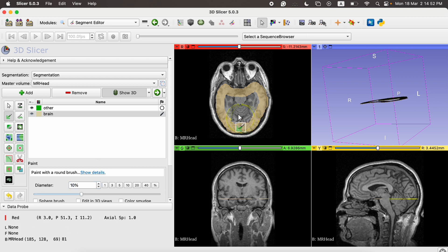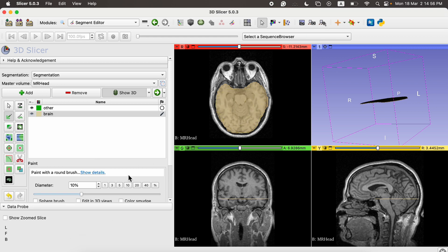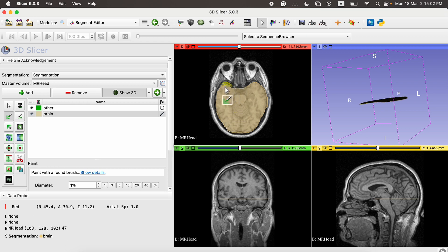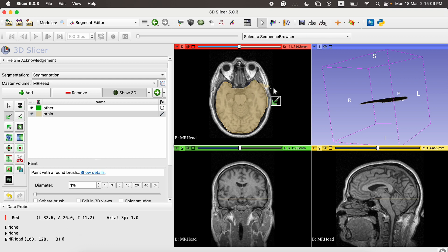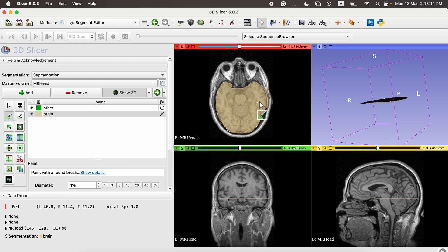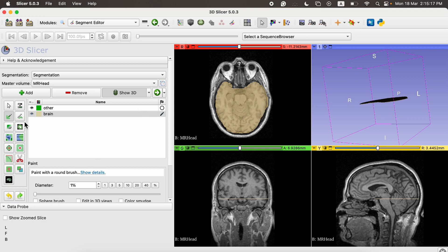We can increase the diameter to cover larger areas, or set it to one for precise segmentation and delineating precise regions. If we make a mistake, we can press Z to undo and Y to redo. These are the core options when working with manual segmentation.